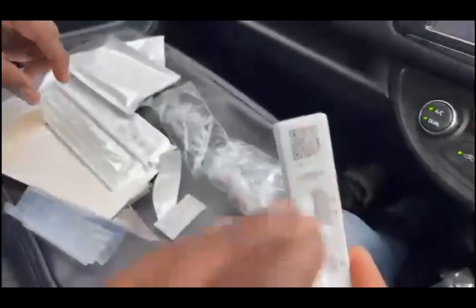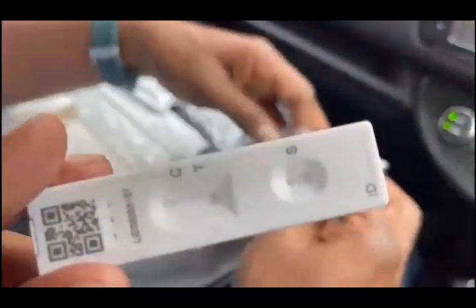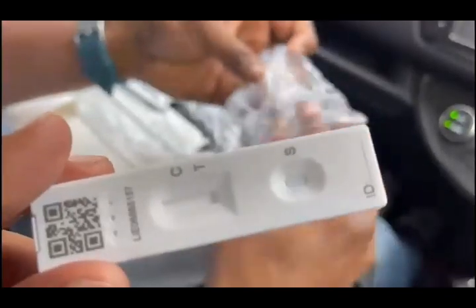I'm going to test — I'll put the pen on it. I'm going to put it on everything, into the tube. I'm going to put it in the solution.